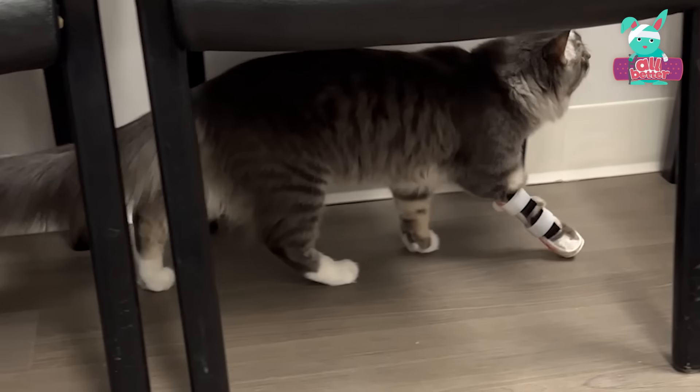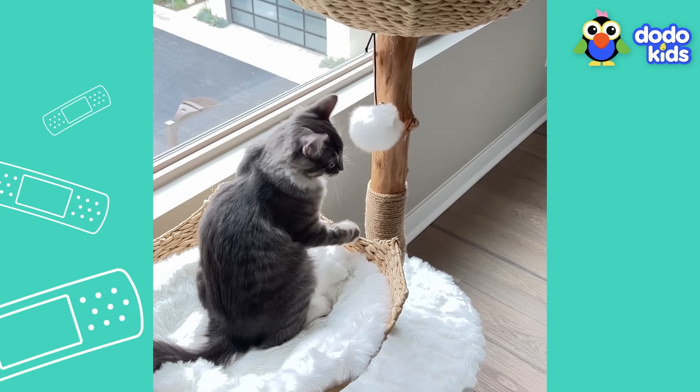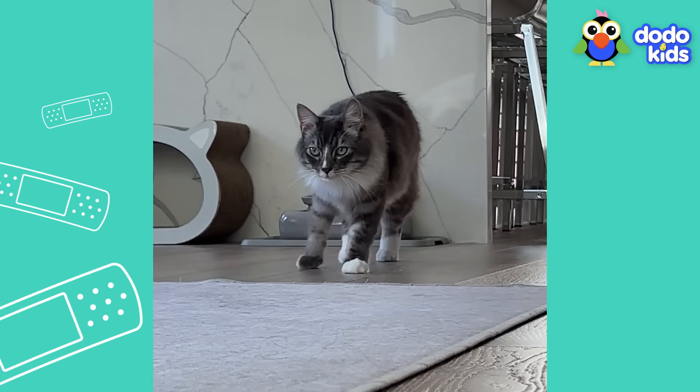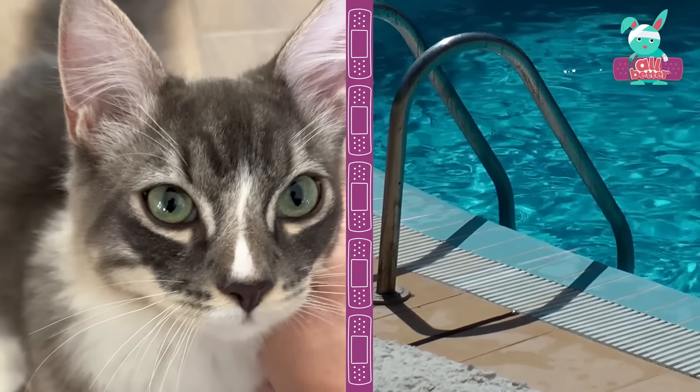It looks like it's helping. You're limping a lot less. But you're not totally better yet. Your leg muscles are still too weak, and the only way to get them stronger is by doing something cats don't normally do. We're going to do water sessions in the pool. You're going swimming!